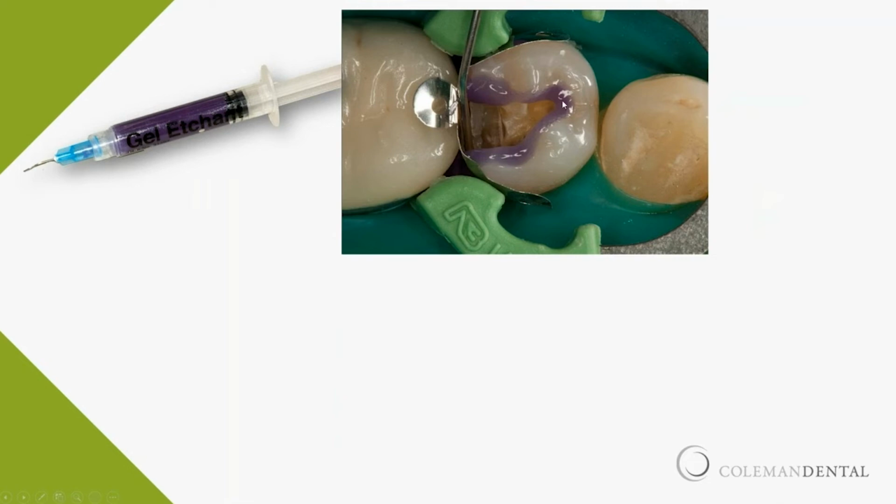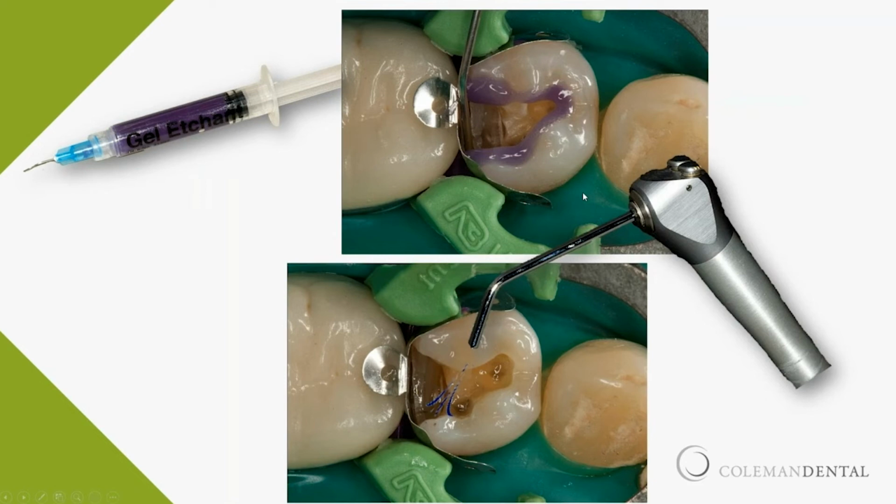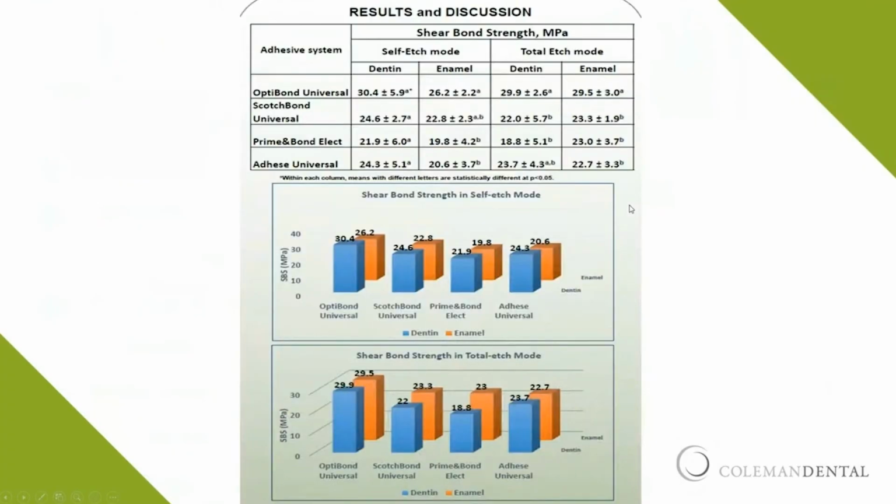I'm a huge selective etch guy. If I'm going to bond to anything, I'm always going to selectively etch the enamel, because you're going to improve bond strengths anywhere from 10 to 15% just by selectively etching. So whether you're using a universal, which is great, I still selectively etch enamel, and you don't want to etch the dentin and enamel. If you're going to use a universal, you could end up with problems with that. Here's the geek in me again.